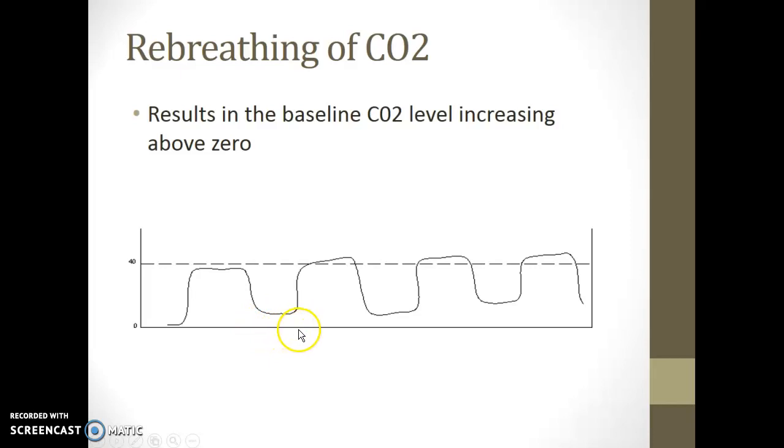All of those should go back down to 0 if we're giving the patient enough time to exhale during each breath. If we don't get down to the 0, then we need to do something, maybe decrease their I time so that we can increase their E time, decrease their tidal volume, increase their flow. There's different things that we can do if somebody's not returning back to baseline.